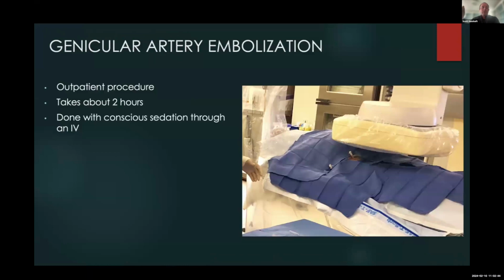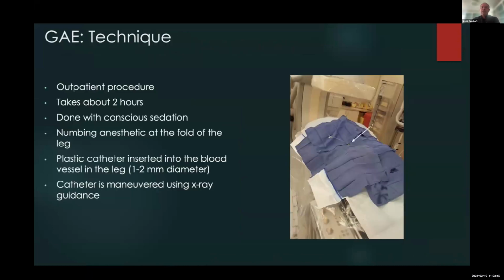This is the setup for a genicular artery embolization. It usually takes somewhere between 60 minutes to 2 hours. We do it with moderate sedation. It's an outpatient procedure. We do it a lot in our outpatient centers where we have excellent equipment here at UCLA. Basically, we get access into the common femoral artery, ideally in an antegrade fashion. It makes the procedure a lot easier.